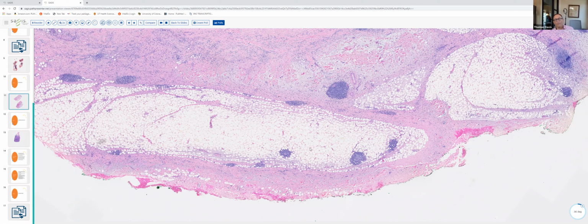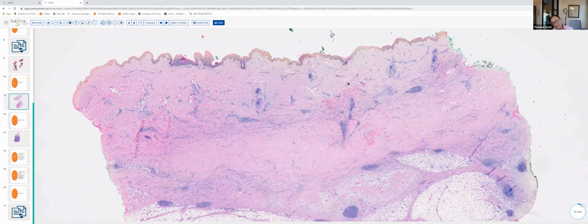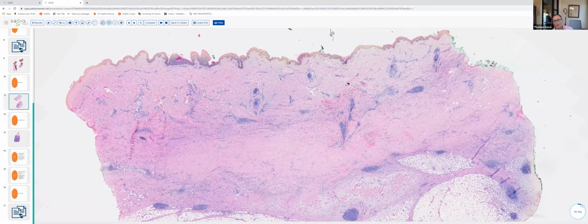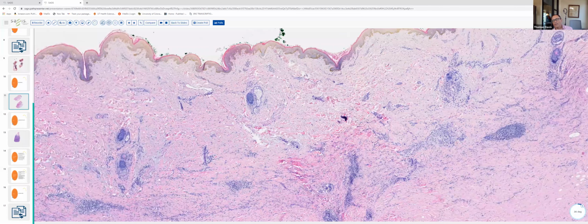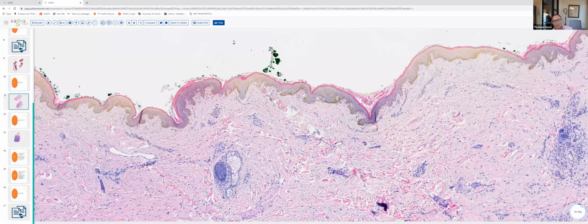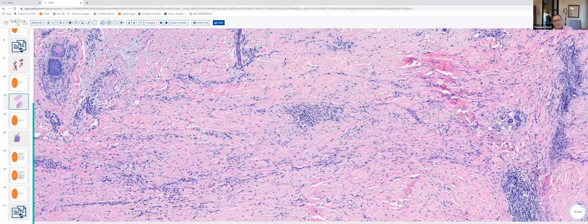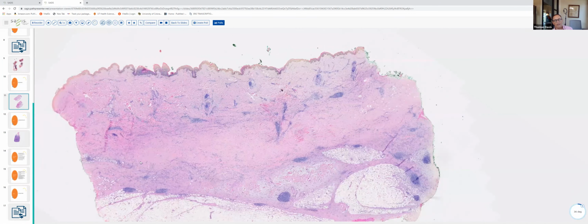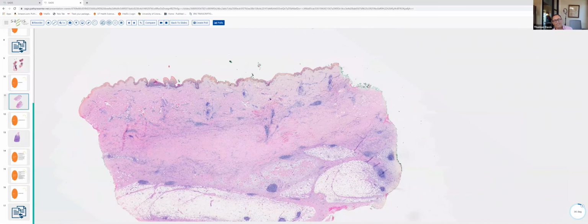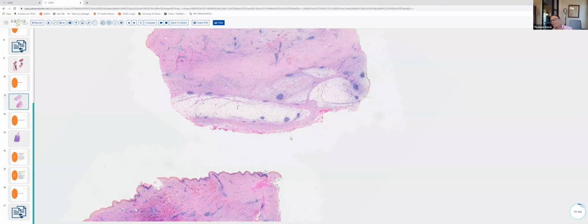Now, another consideration that I had when I saw this case, especially if this is an isolated indurated lesion, is the possibility of a desmoplastic melanoma. Again, when we see spindled cells in the dermis and these lymphoid aggregates, you always want to be attuned to that possibility. There was certainly nothing here along the dermal epidermal junction in terms of melanoma in situ. A MART1 stain was negative, and we went ahead and did S100 and SOX10 staining, and there was absolutely no appreciable decoration of cells in the dermis, allowing us to exclude that as a possibility. But in any case, nice example of deep morphea with extension into the underlying subcutaneous tissue, producing a septal paniculitis.